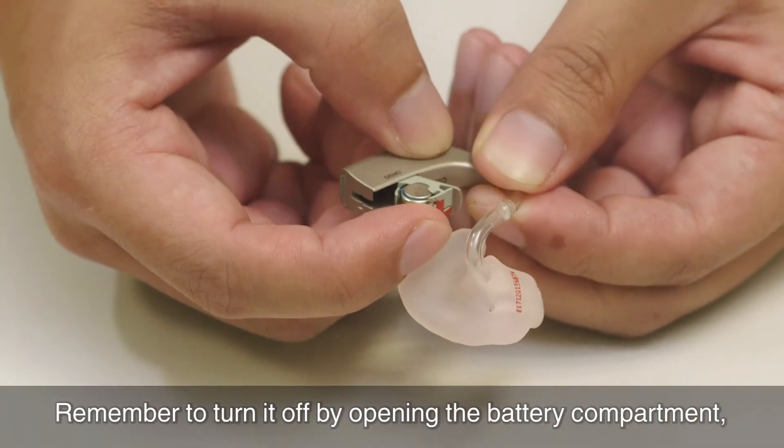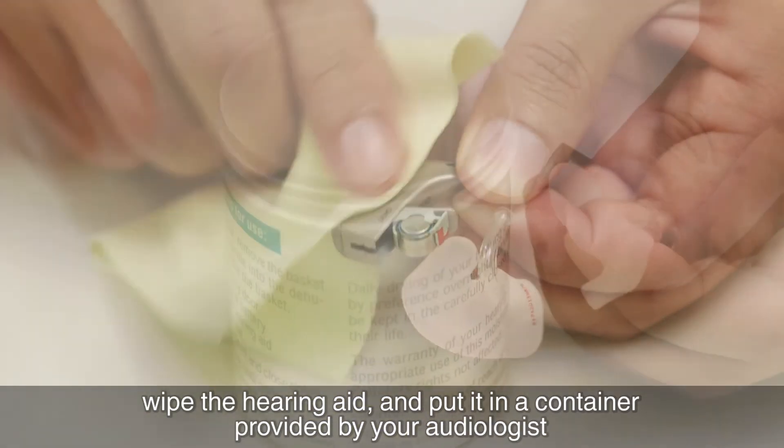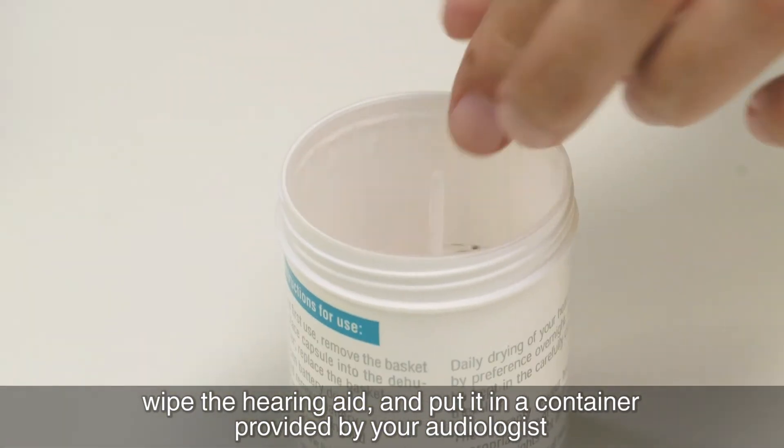Remember to turn it off by opening the battery compartment, wipe the hearing aid and put it in a container provided by your audiologist.